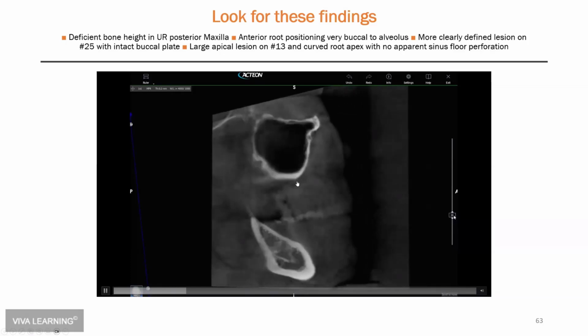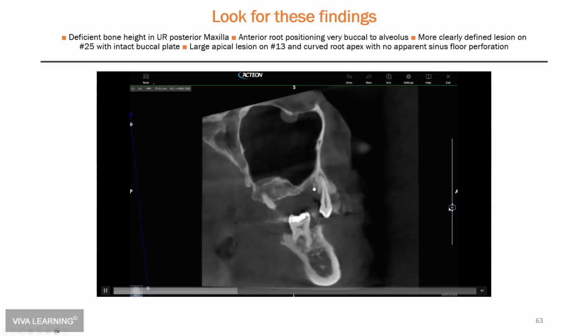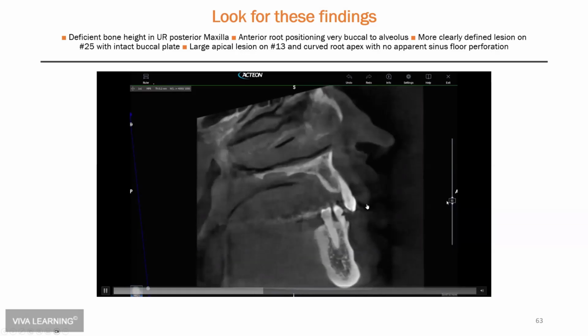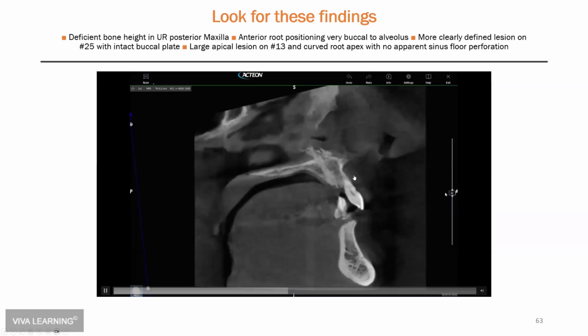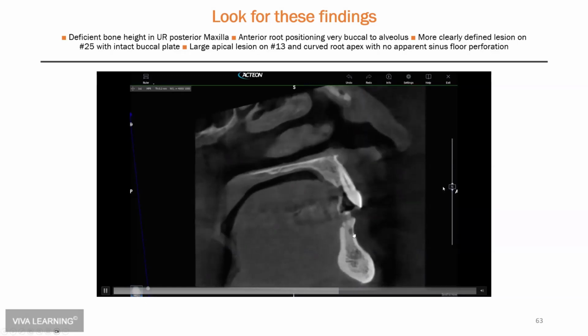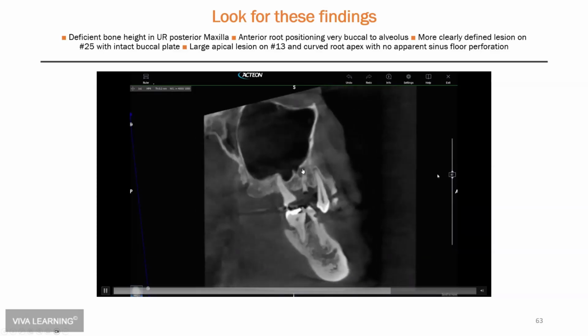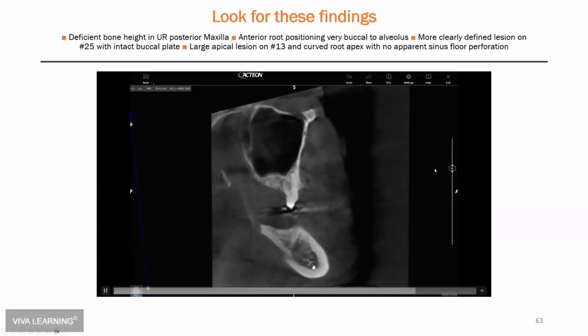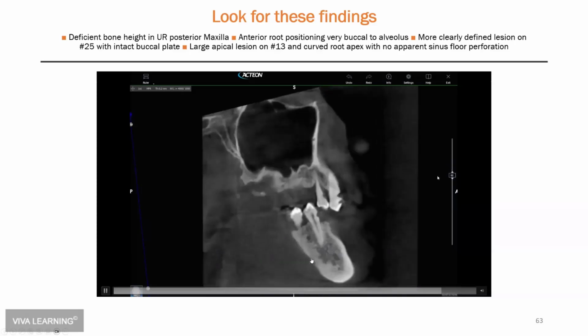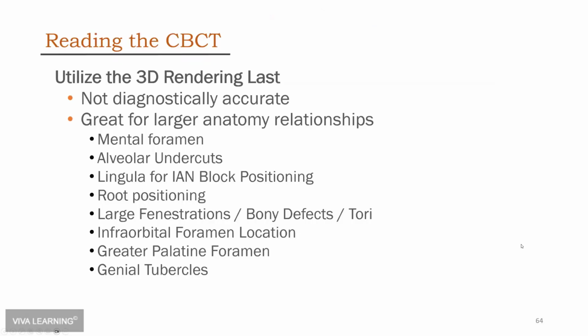We're going to scroll past it again. Hard to say what happened there. As we come forward to the anterior teeth, we get a really good view of how buccally positioned these front teeth are. And there's the abscess at 25 right there. And then here's this little hooked root on 13. But there's still a bony wall between it and the sinus. So that's good stuff to know. Okay, and we get a good view of this person has a lot of abfraction lesions. That's why you're seeing a lot of those weird cuts right at the CEJ.